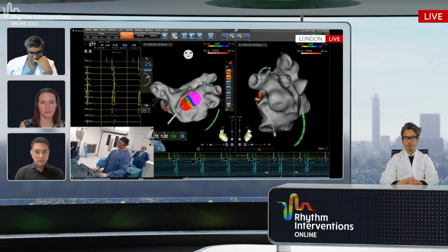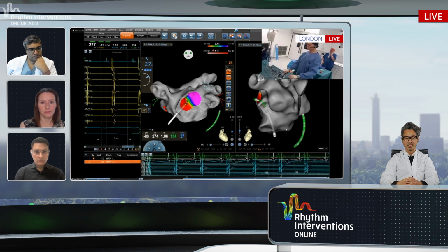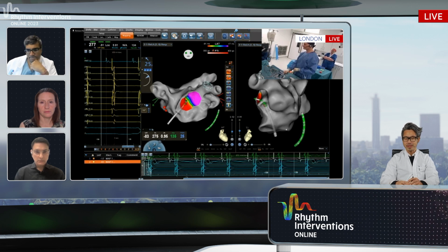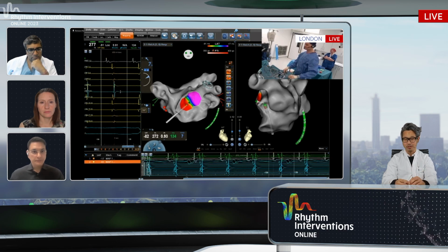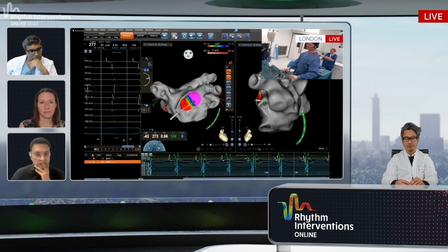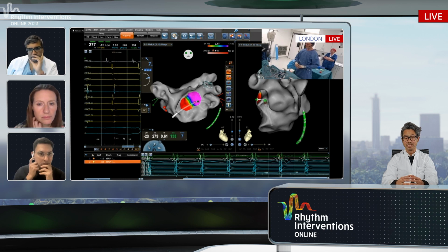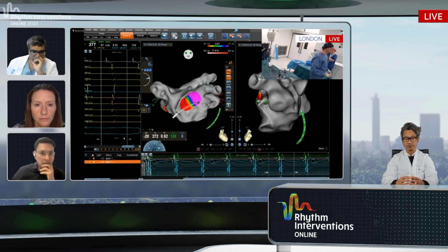Yeah, Richard, you did a beautiful and very didactic explanation of what you do, and that's great. I think in the interest of better understanding your signals, it may be good to sometimes highlight the signals, because we sometimes just see the Carto in a pretty small way, the signals and orientation. So I assume that the lasso, the former LA signals, initially was yellow, and now it's the blue signals, correct?